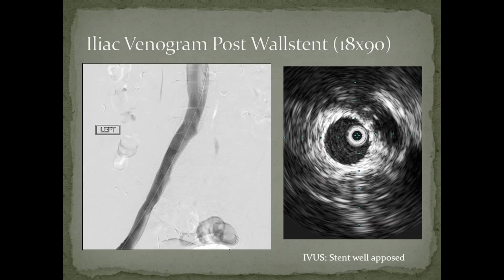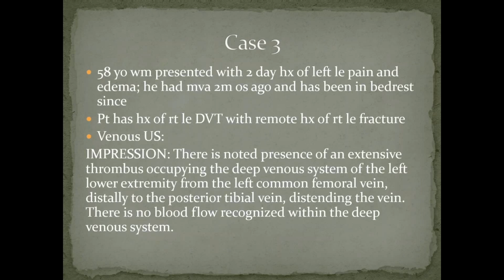So this is a stent image. This is a venogram post-stenting, and this is the intravascular ultrasound showing excellent stent apposition. So I was very happy with this. The patient did well, and the leg decompressed.